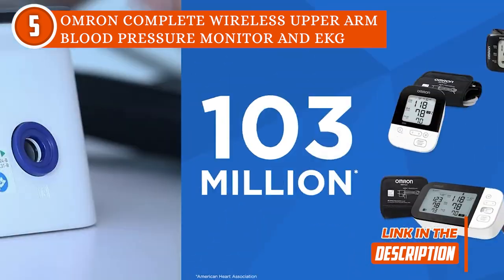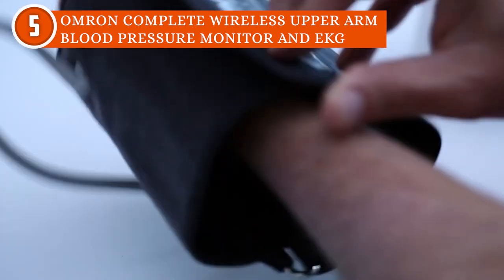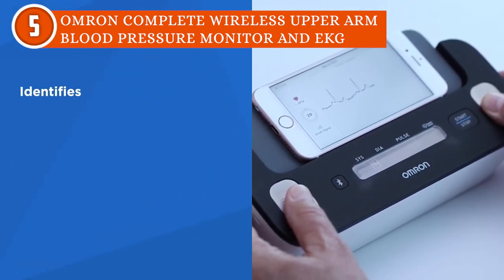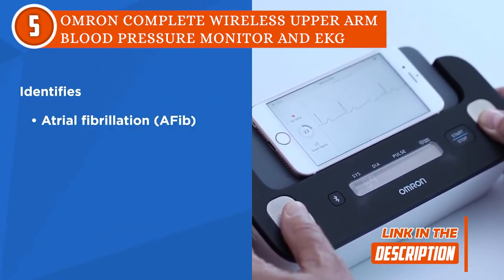This monitor complies with ANSI, AMI, and ISO validation protocols and meets the highest standards for precision and reliability. In one go, it measures systolic, diastolic, pulse, atrial fibrillation, tachycardia, bradycardia, and sinus rhythm, which you can show to your doctors to help them make better decisions about your treatment plan.